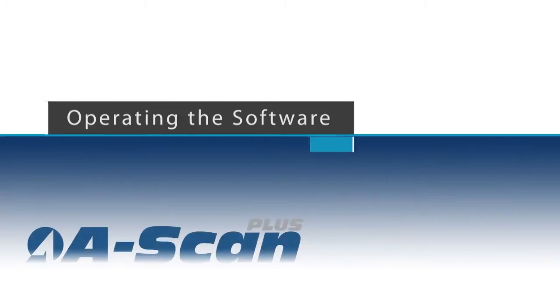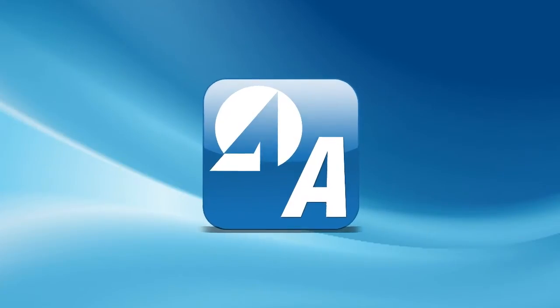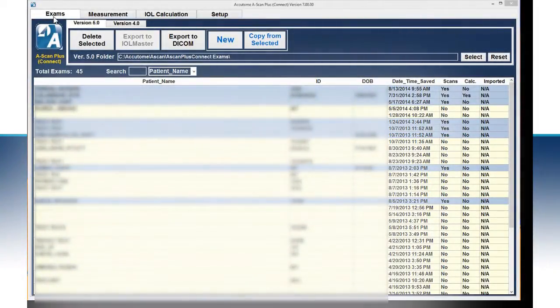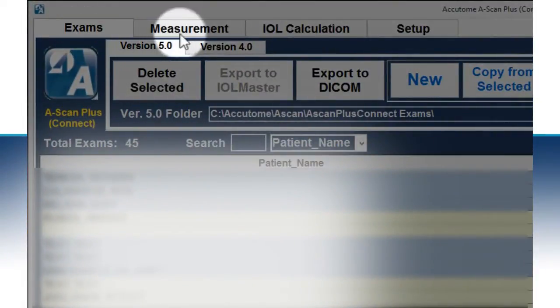Operating the software. Once installed, the Accutome logo will appear on your desktop. In order to start the software, simply click on the icon. The software will open on the exam screen. You will see four tabs on the top: Exams, Measurement, IOL Calculation, and Setup.